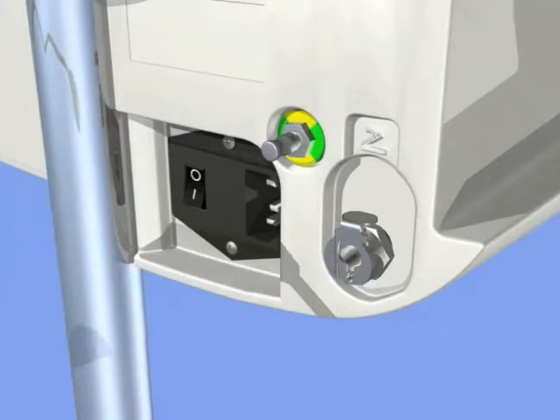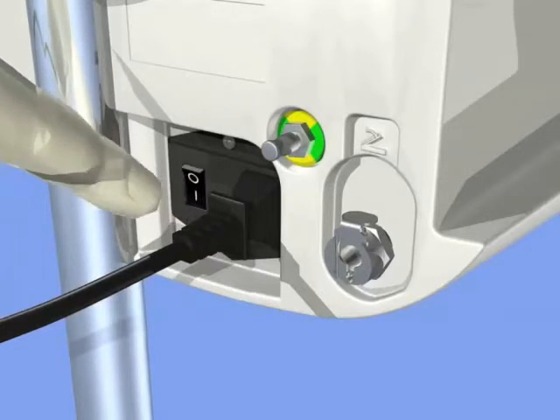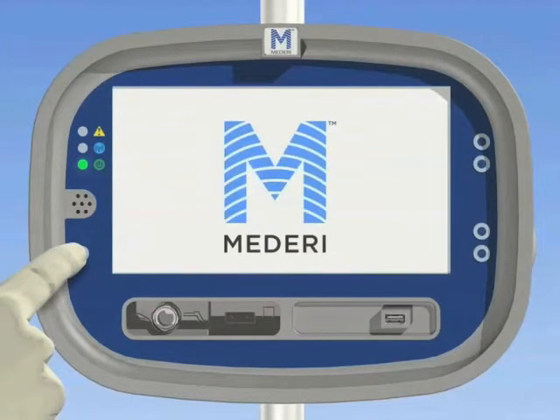After installation, plug in the RF generator and turn on the main switch on the back of the unit. A self-test will automatically commence. The red, blue, and green LED lights will be active. When the red and blue lights go off and the power light is flashing slowly, press and hold the power on mode button for at least 3 seconds until the Mederi logo appears. The generator will automatically go into setup mode when it is ready.